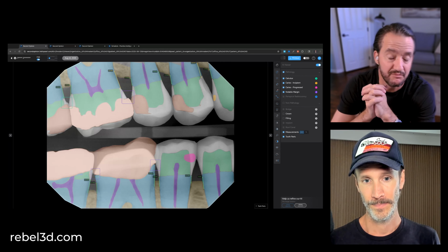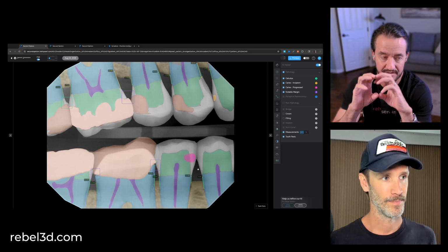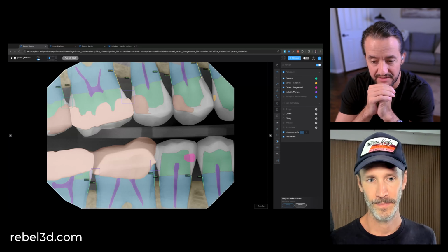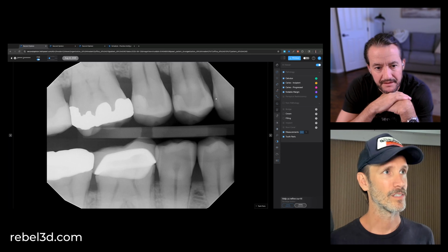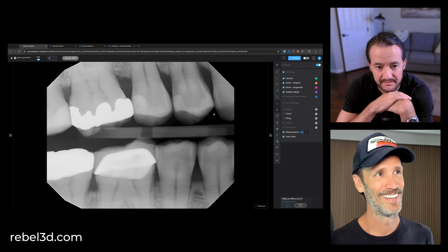Yeah, that's a much more objective conversation, and you're differentiating that yes, there are cavities in both areas, but one has a different level of severity than the other, and we can clearly talk about it, show it in a way that I can see and digest and agree with you. Yeah, because look, if I showed you this, do you see that little area? That's really hard to see with the naked eye.